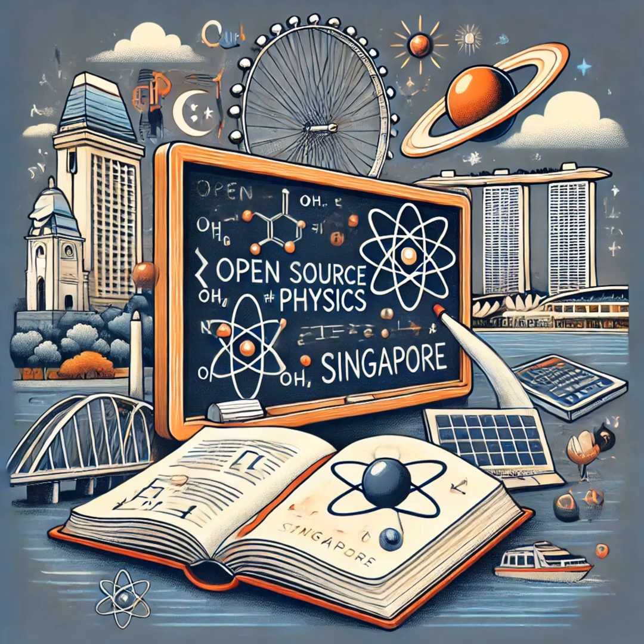So it's not just about taking a picture. It's about creating an image that accurately represents what's inside. Exactly. And that's where all those settings we talked about come in. The kVp and mAs and all that. Right. kVp, mAs, filtration, source to image distance, they all play a role in how much radiation different tissues absorb. Okay, I see. Remember how we talked about filtration being like putting a filter on a flashlight? Yeah, to make the beam more focused. Exactly. So how do you think that affects what we see in the X-ray image?